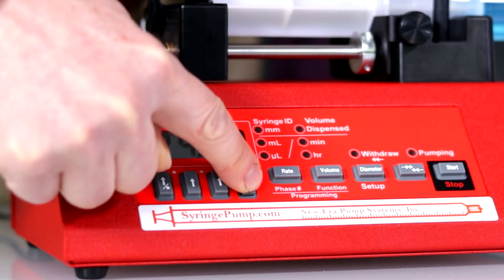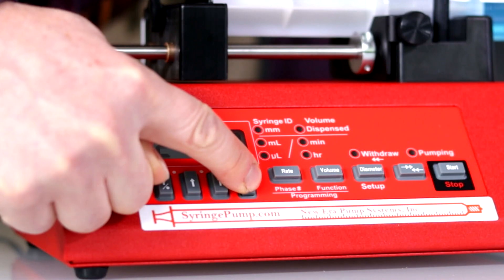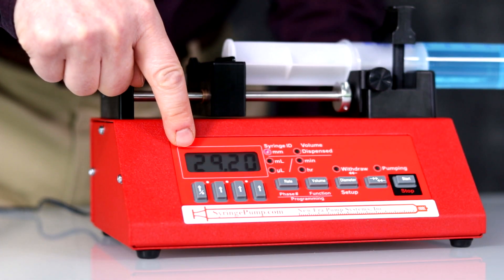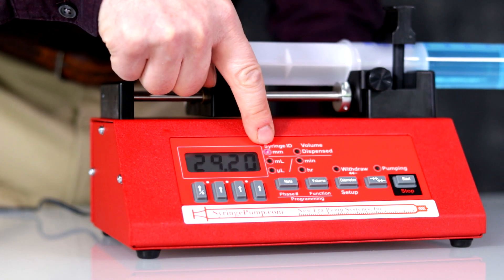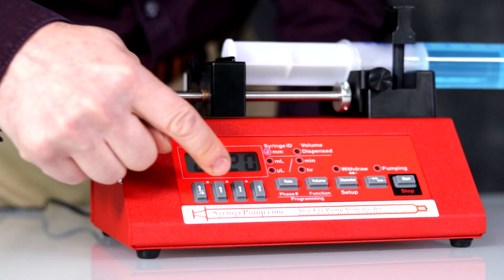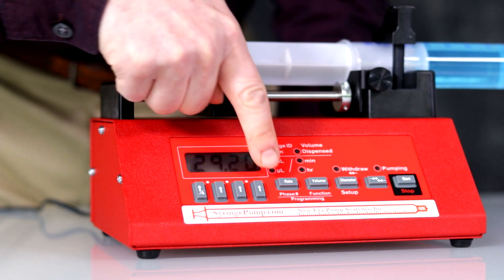Press and hold the key to quickly increment the digits. When entered, the display will blink and the LED will stop blinking. NE1000, set the rate of infusion. To set the rate of infusion, press the rate key.